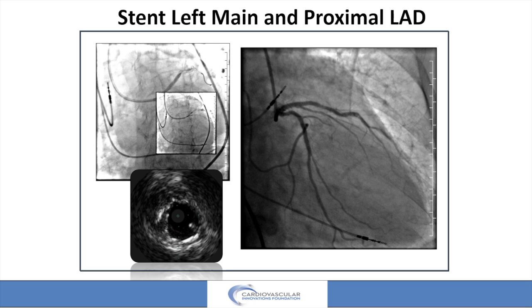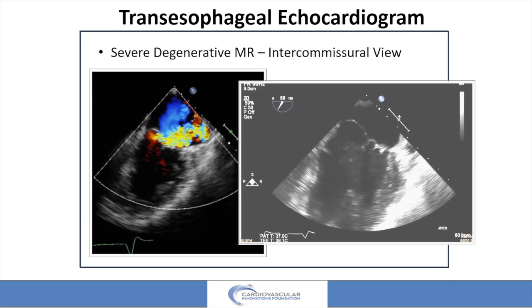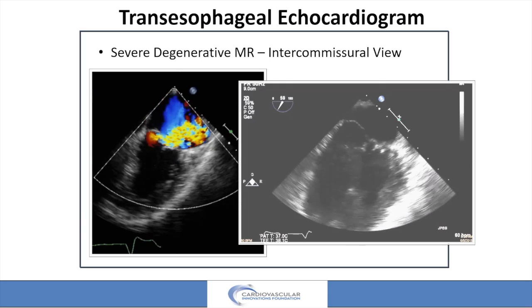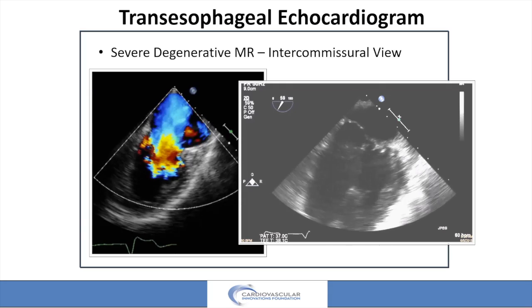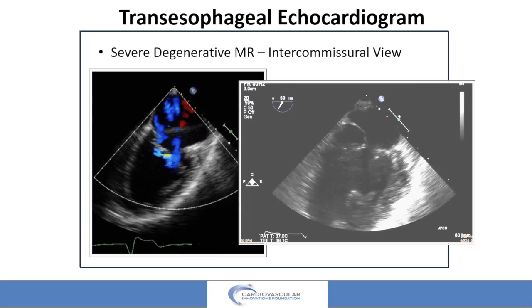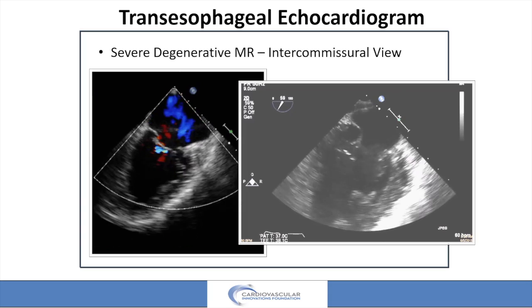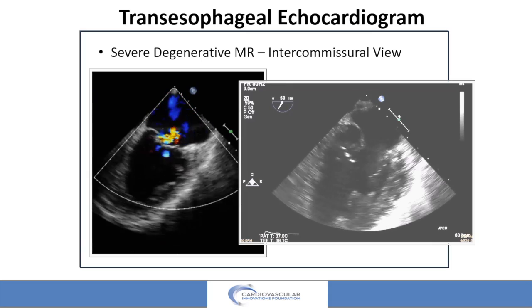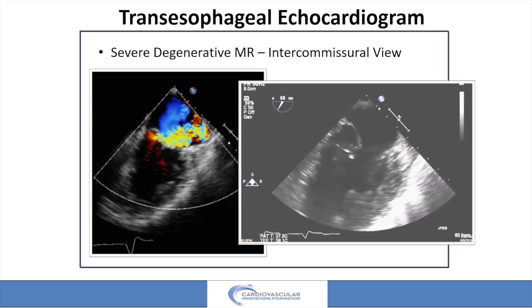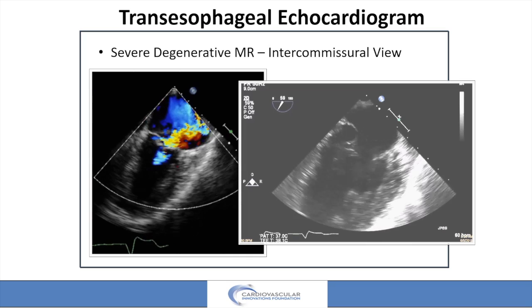We went ahead and rotablated the left main and LAD and stented them both with a nice result. Then we brought him in for a live case. Here's a bit more TEE — you can see here in the bicommissural views severe medial prolapse of both leaflets, particularly the posterior leaflet that doesn't have a lot of secondary chordal support. There is a little flail, and 4-plus MR.